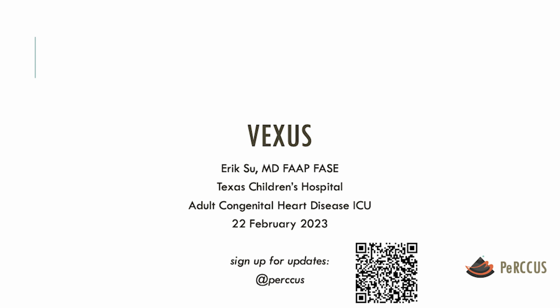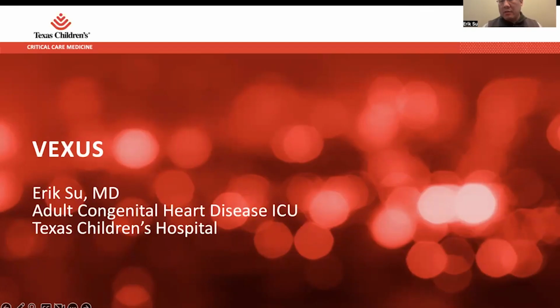We're just going to talk a little bit about VExUS, which has received a lot of attention recently in terms of evaluation of the fluid overloaded patient and whether or not it can serve as a surrogate for other metrics of overall fluid status, but primarily in the overloaded state.